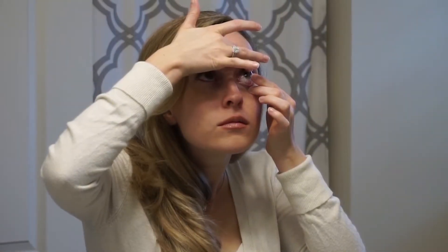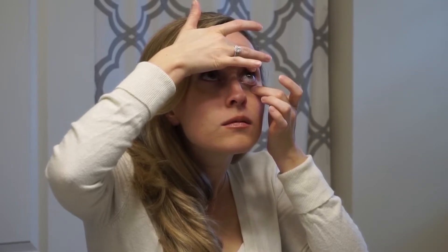Step 7: Place the contact lens onto the front of your eye. Note: some people find it easier to look up or down and place the contact lens onto the white part of their eye instead.